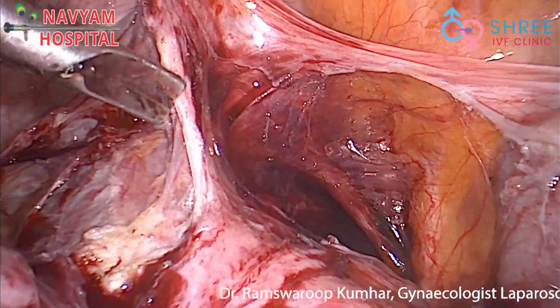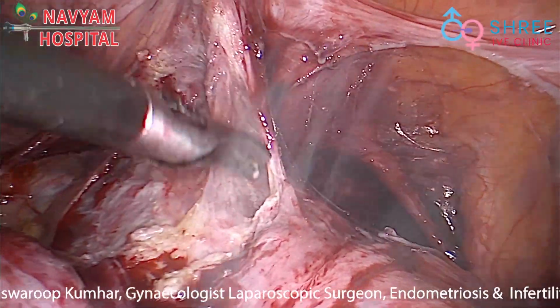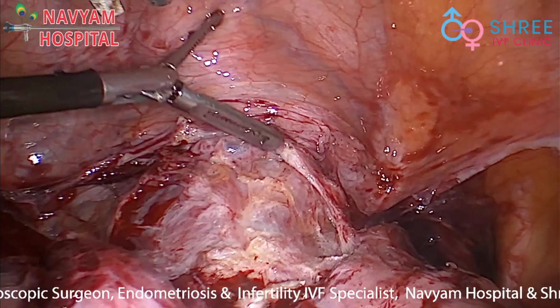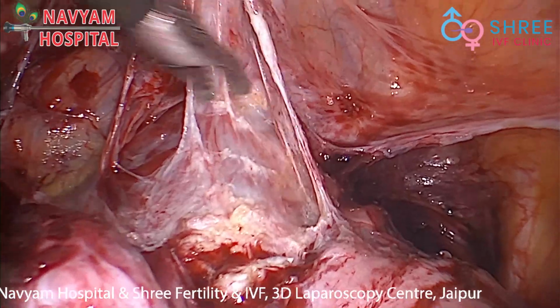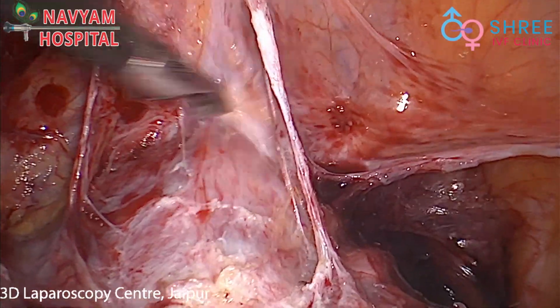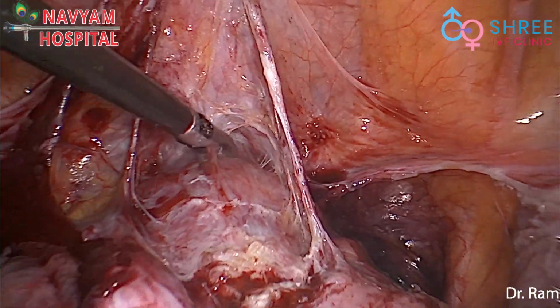Few fibers on the right lateral part are being cut and the bladder is dissected deep down. Now the bladder is again held and traction was given anteriorly and the remaining part of the bladder was dissected, and now you can see the bladder is dissected very deep down, and if the need arises we can dissect the bladder down further.